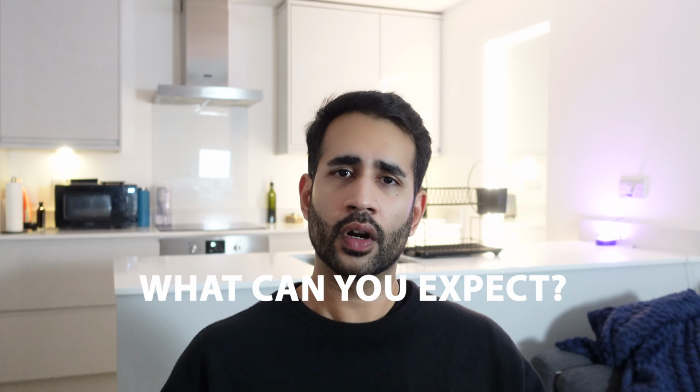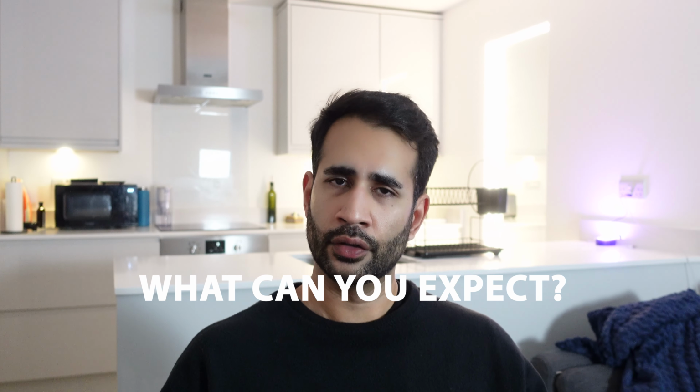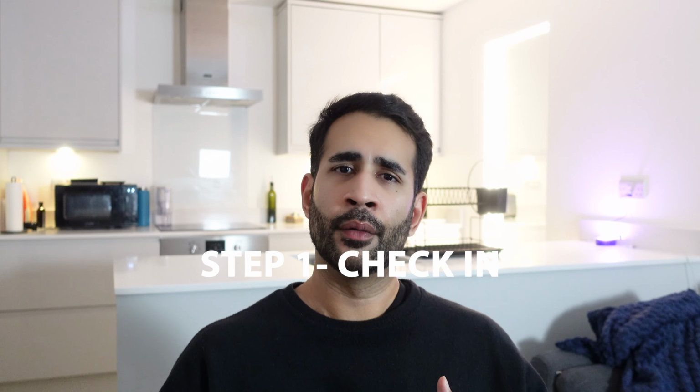So what can you expect? So basically, you'll get your referral form from your GP or whichever physician is referring you to get it done. You'll turn up to the radiology clinic. Now, first, obviously, you'll line up, you'll do all your paperwork, and a radiographer will probably come and have a chat to you. Now, a radiographer is one of the technicians who will usually perform the scans, and they'll help the radiologist with doing the actual procedure itself.